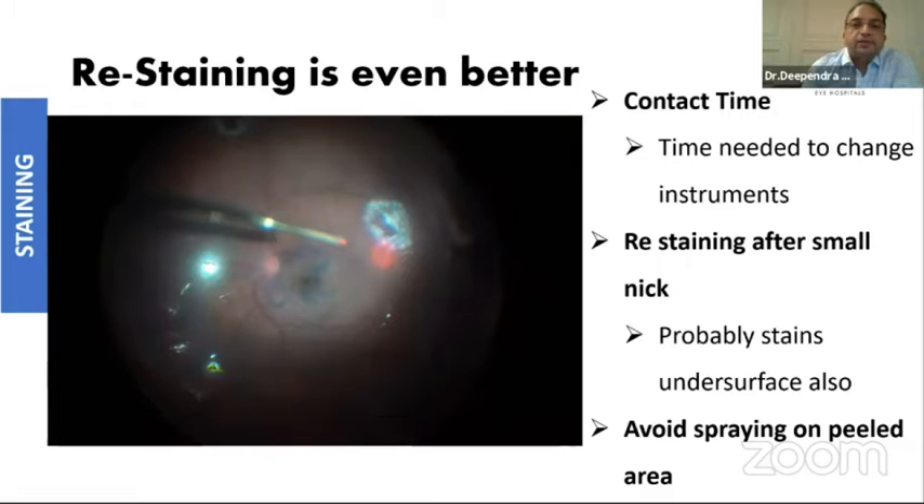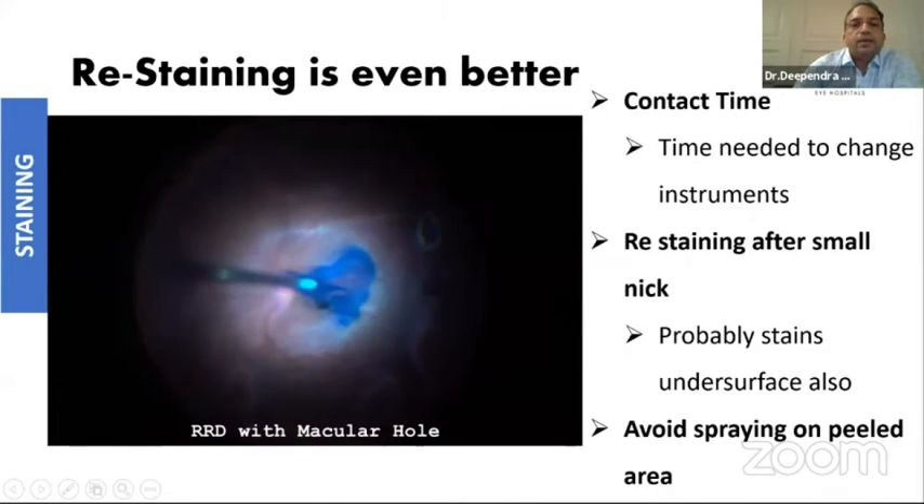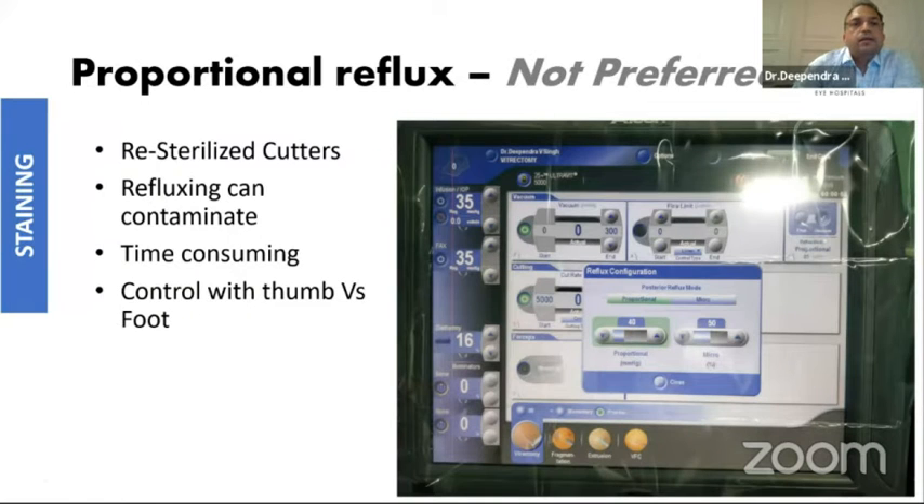As you can see, once I have restained, the flap is so nicely visible in these cases. Visualizing the flap even after peeling is important these days because you are using flaps to cover macular holes. This is a very useful tip — to restain so that you can see the flap during fluid-air exchange. Of course, for the area which you have already peeled, try to avoid spraying on that area, so you need to be selective about where you stain.